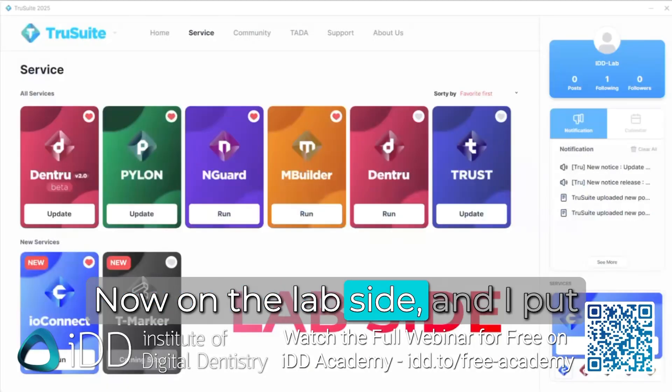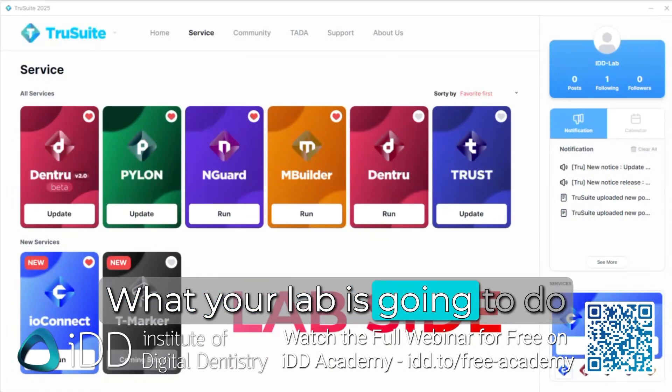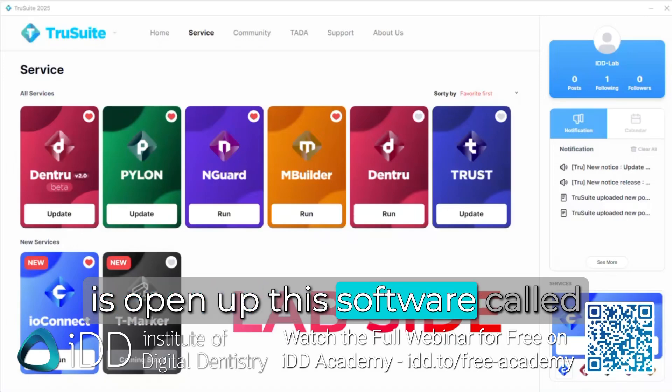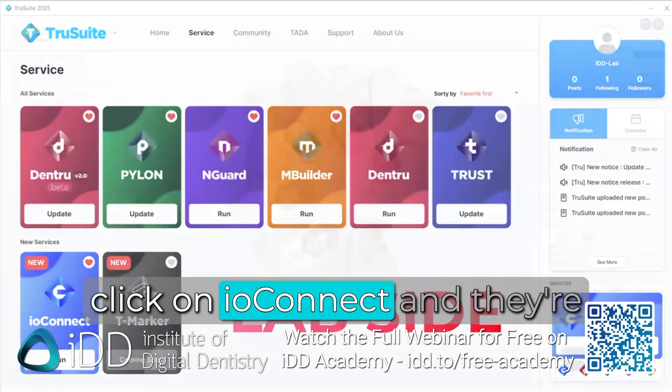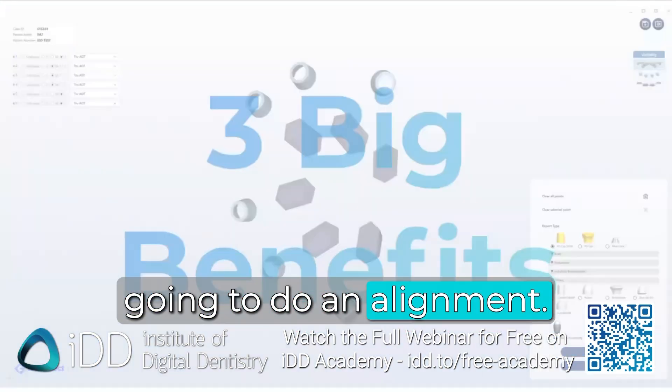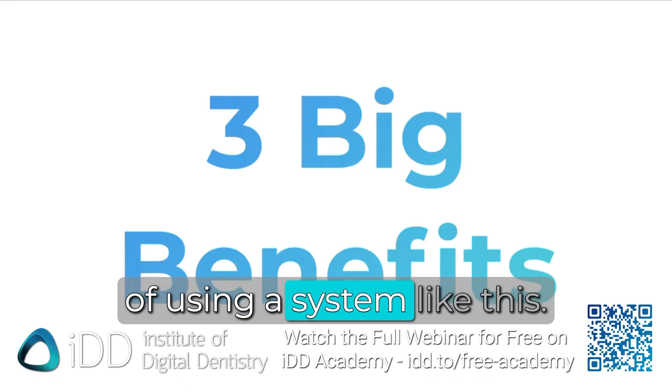On the lab side — and I put lab side here in red because I don't want to scare you — what your lab is going to do is open up software called TrueSuite, click on IO Connect, and do an alignment.